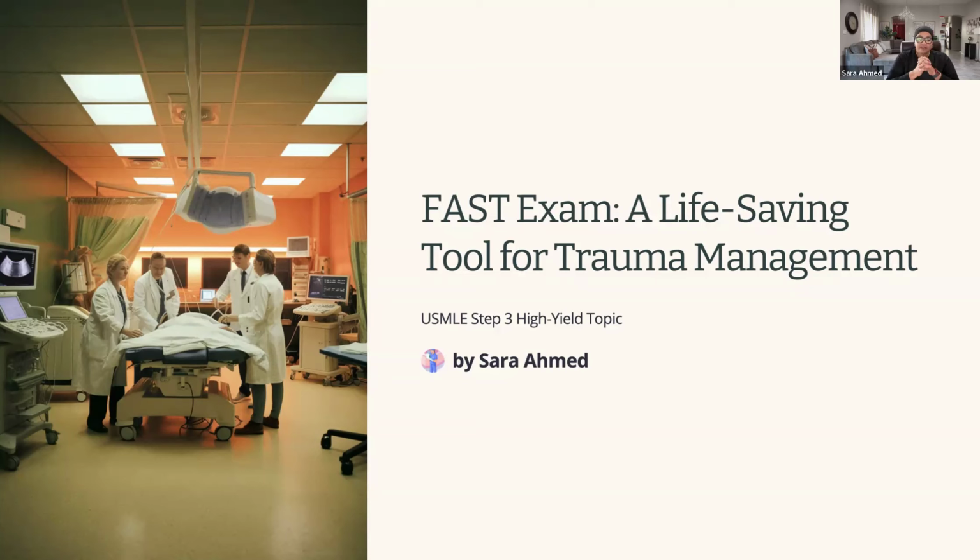Today, we are talking about the FAST exam, which is an acronym for Focused Assessment with Sonography in Trauma. This is a rapid bedside tool that helps identify life-threatening injuries in trauma patients, like pericardial tamponade, hemoperitoneum, and hemothorax. A must-know concept for the USMLE Step 3, because it's not only testable in multiple choice questions, but also essential for clinical case scenarios, CCS.